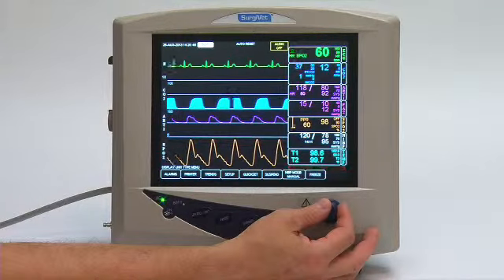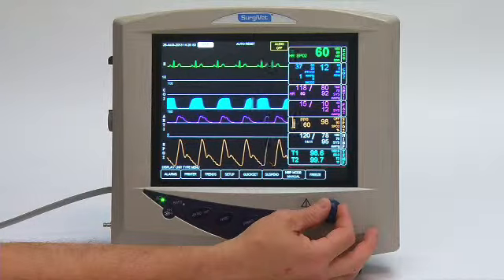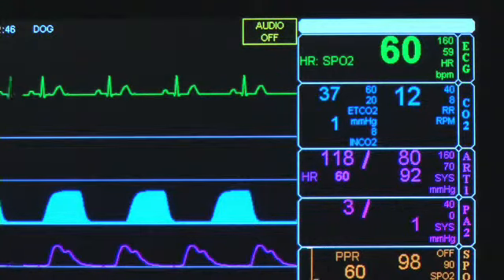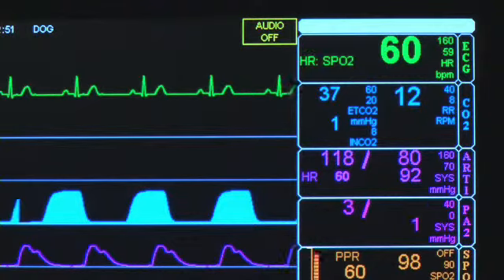The monitor allows patient monitoring with adjustable alarm limits, as well as visible and audible alarm signals. The cursor will jump over the Alarm Mode area on the top of the screen, as it is for alarm information only and cannot be manipulated.